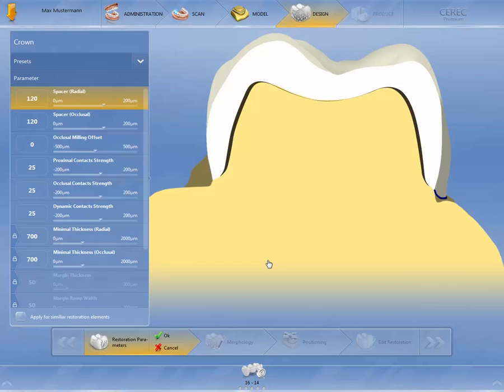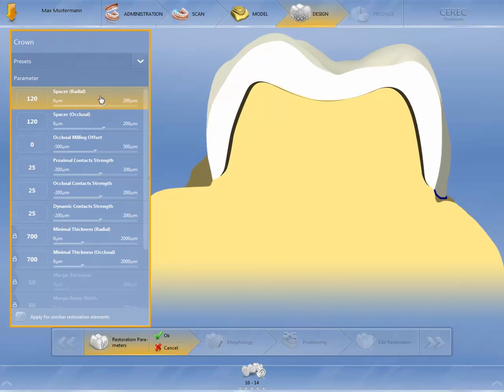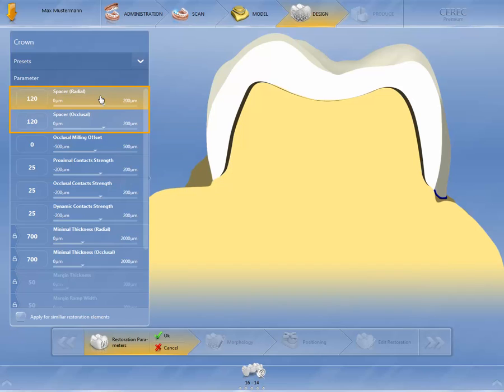First of all, you should check the parameters for your restoration elements. The spacer describes the space for the cementation material on the fitting side of the restoration. Different spacers can be set for the radial and occlusal surfaces.